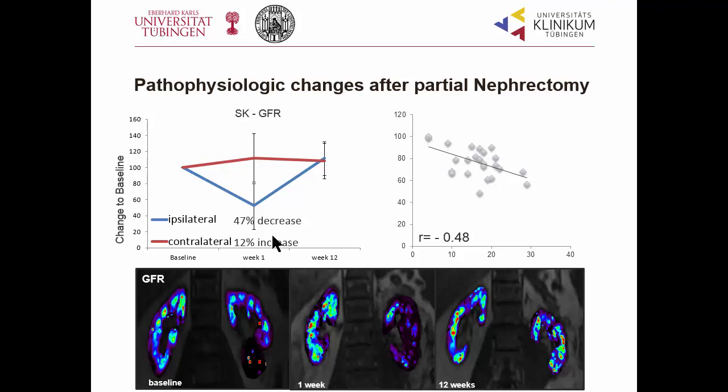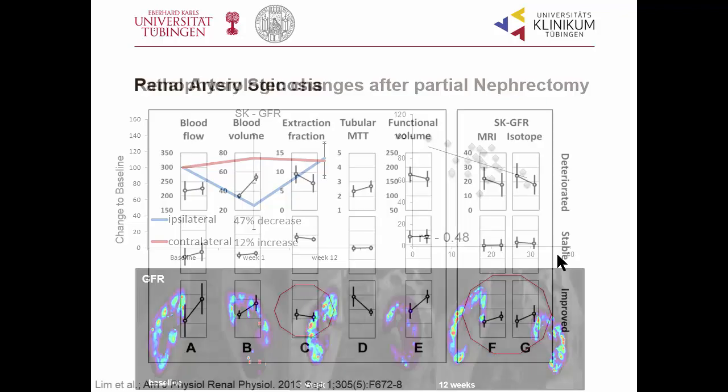And I think this is interesting data to understand what is happening after ischemia reperfusion in the kidney and how kidney function returns just after 3 months. And there's also a correlation of the decrease of renal function correlated to the clamping time.